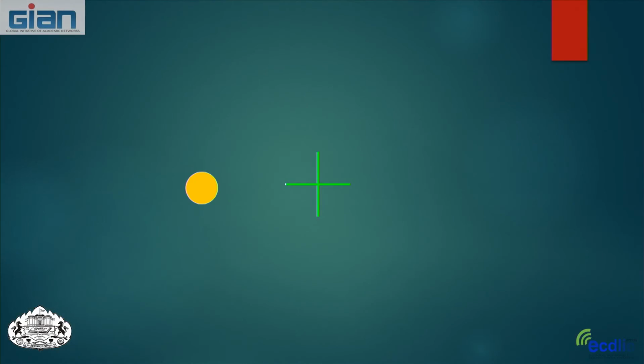Okay, the next one's the harder one. So again, what's going to happen is if you see the crosshair turn green, you're going to look towards the dot that pops up. If you see it turn red, you're going to look exactly in the opposite location on the horizontal axis there. Okay, so there's our dot. Then we look towards it, right? So you're going to look to the other side, but it's very hard to do because the first thing you do is look at that dot. So that's the Antisaccade task.